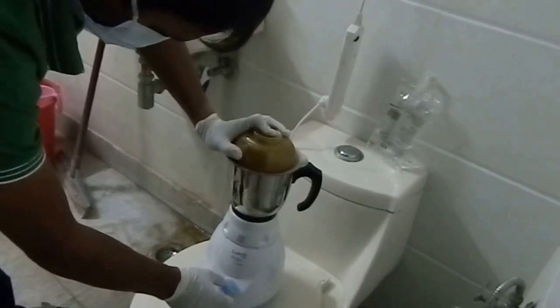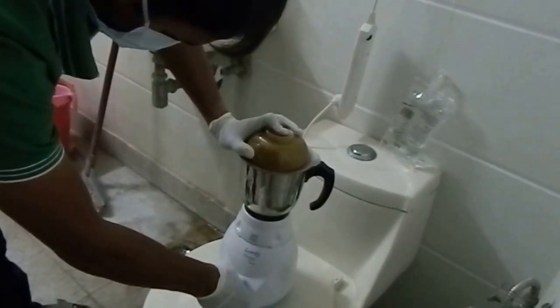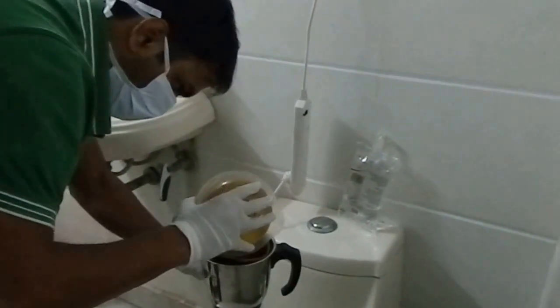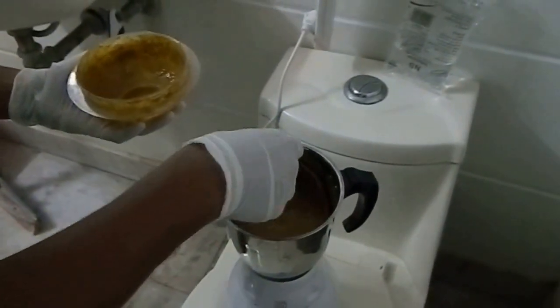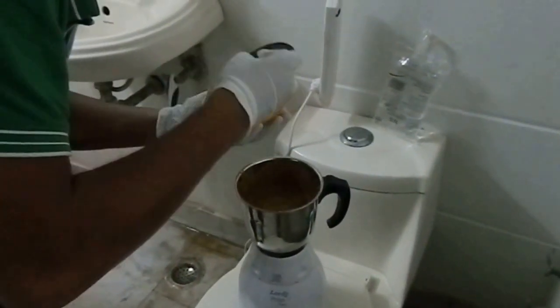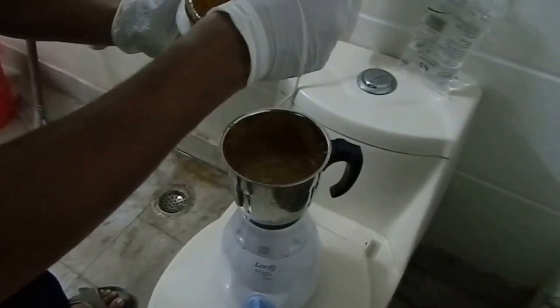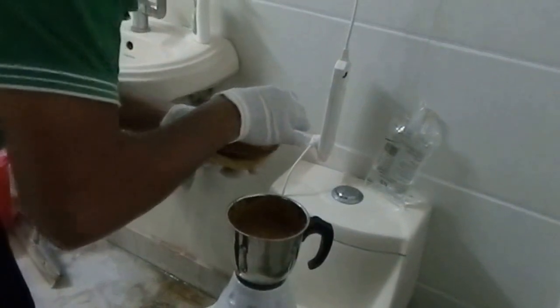You want to make it consistent. Now we will check for consistency. As you can see, if you come close up — such things will keep happening so you have to be more comfortable with your poop. As you can see this is not as liquid as we would want it to be, so we would want to add a little bit more saline so that it can actually pass through the strainer. We will add just a little bit more saline to make it more fluid, so to speak.